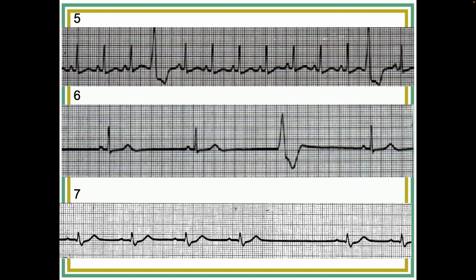So another way to think of it is like this. And then in a minute, we'll talk about why this one is particularly like this. Think of a premature beat as one that comes in early, and an escape beat as one that comes in not early. So you can include things that come in right on time, as this one does, for an escape beat. Oh, I see what you're saying. Can you explain that one more time, please? Okay, so let's do this.